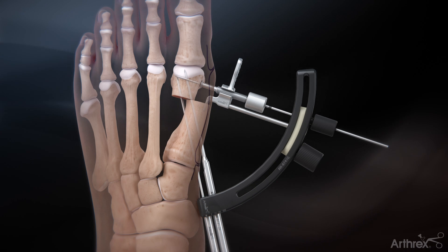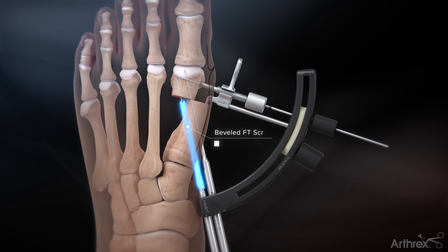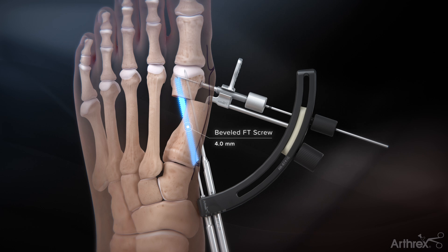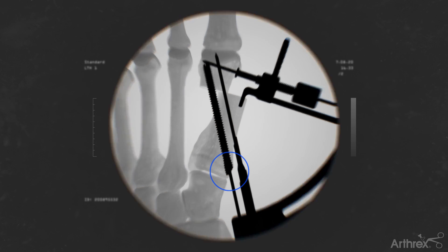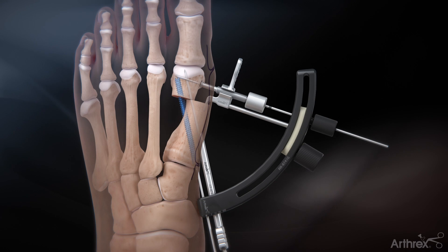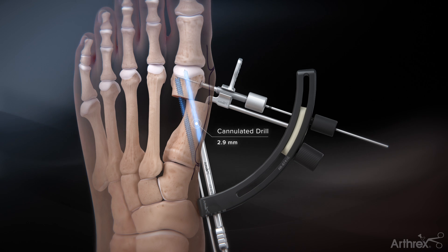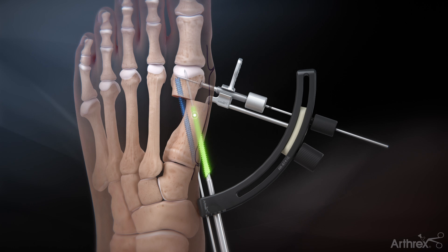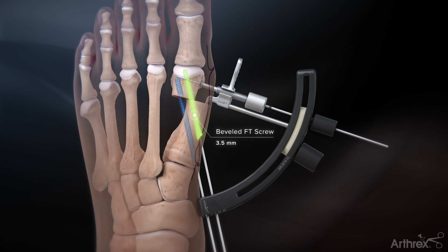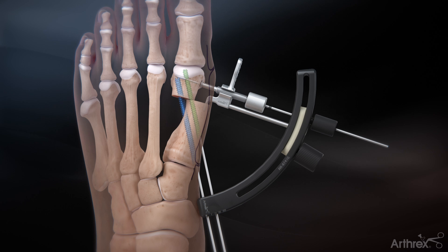Remove the drill sleeve and insert the appropriate length 4.0 mm screw over the proximal guide wire. With fluoroscopic assistance, confirm that the bevel of the screw aligns with the surface of the metatarsal. Repeat the measure, drill, and insertion steps for the distal screw. Two 4.0 mm screws or two 3.5 mm beveled FT screws can be used. Final adjustments to screw placement may be made by hand.